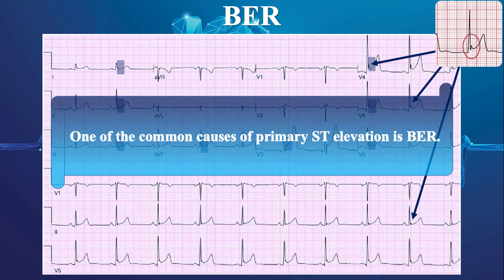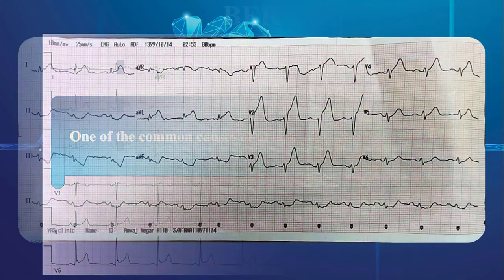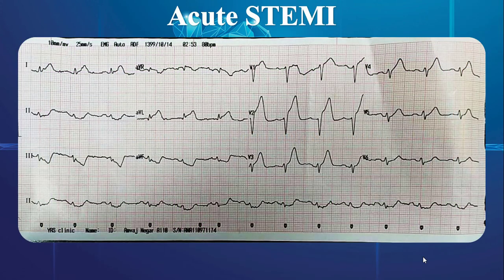The last strip demonstrates acute anterior ST elevation MI. There are obvious ST elevations in V1 to V4 with reciprocal ST depressions in inferior leads that highly favor acute ST elevation MI.